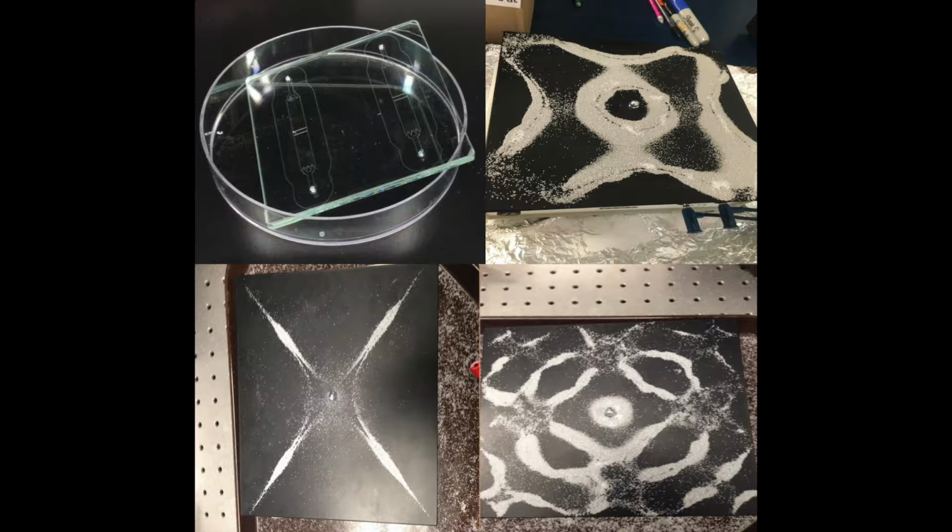We also measured frequencies where we saw focusing and compared those values to the complexity of focused shapes. We recorded and compared particle sizes and densities. We compared the time it took for different particles to focus, and we compared the focusing patterns of different particles.